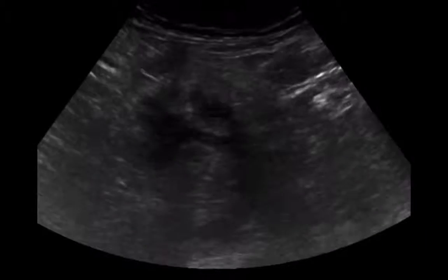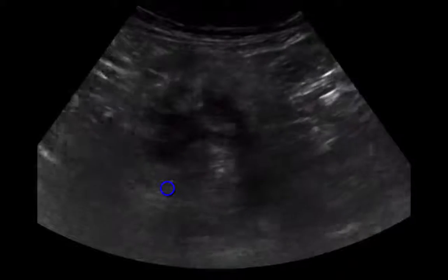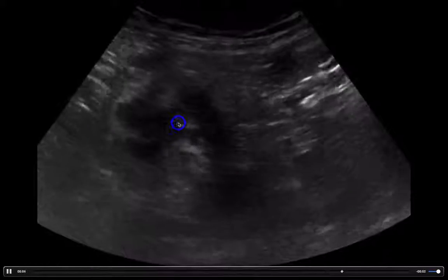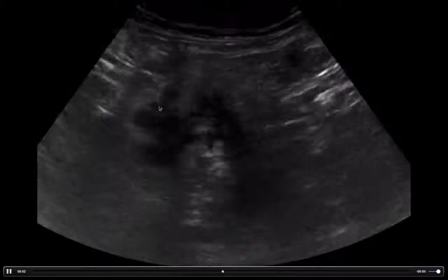Sometimes you're going to get to these patients a little bit later. This is a patient that had a ruptured appendicitis. You can see a small tubular structure right about there, right there, and all this is surrounding edema from that rupture. It's probably just a contained abscess on this patient.